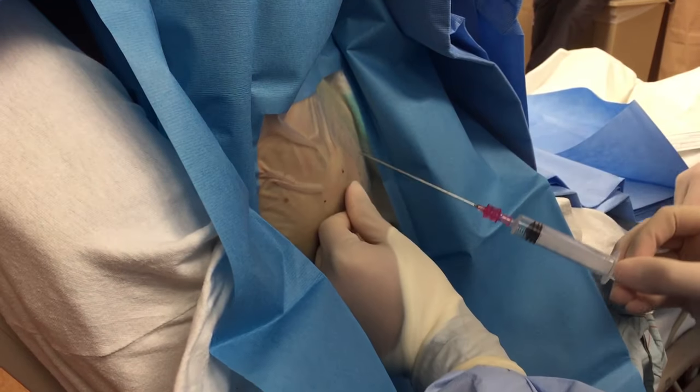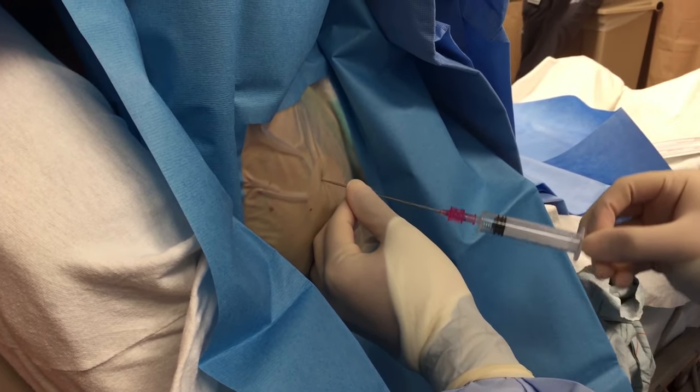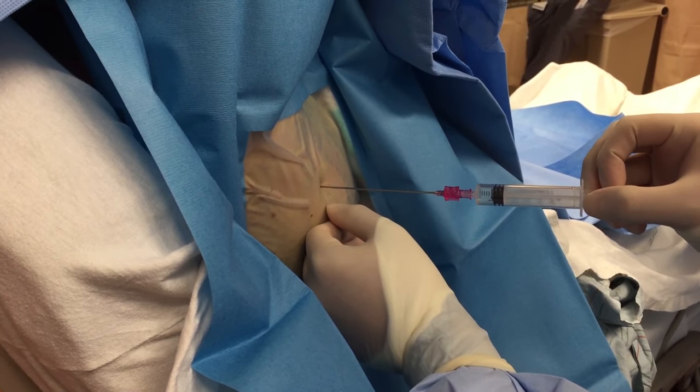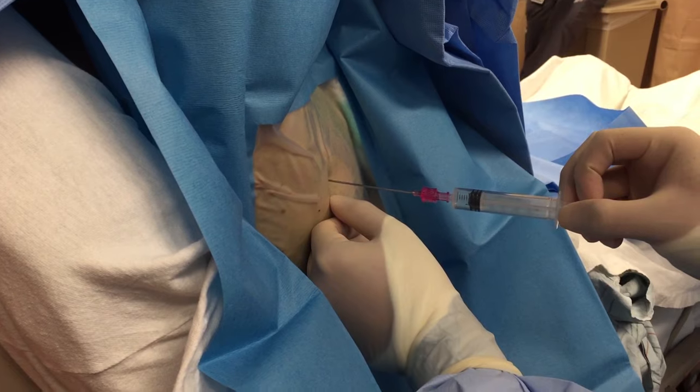So you're going straight in. You might hit rib. You're going to feel some pressure. If you feel pain, tell us and we'll stop and give you some more pain meds. Pulling back the whole time.